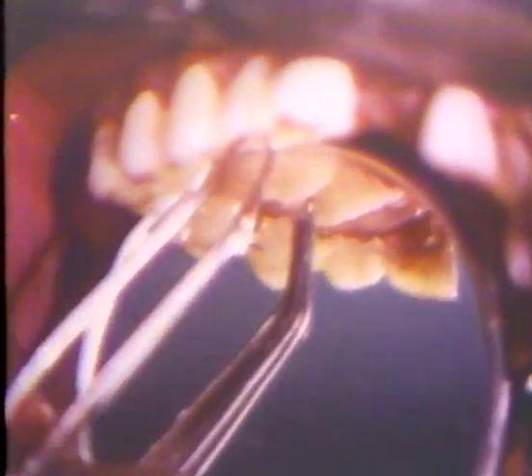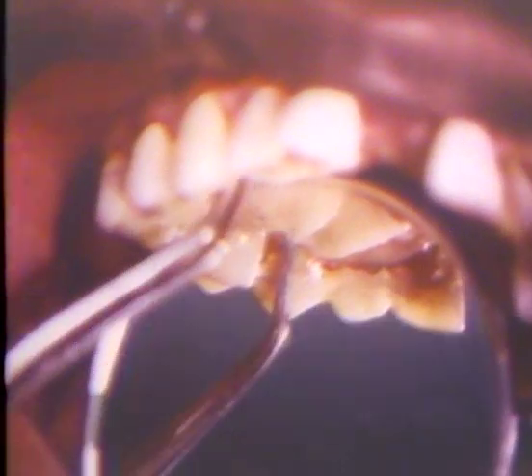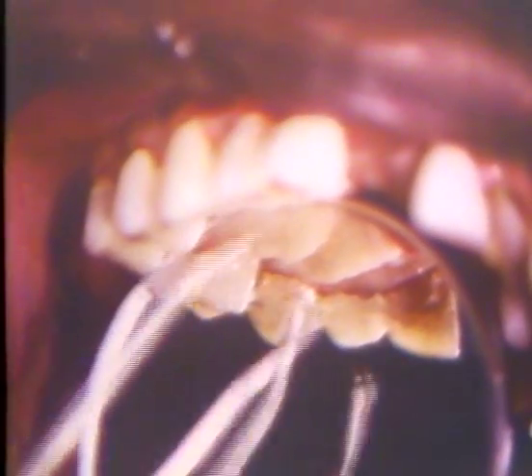Once the pocket mark has been made on the labial and buccal surfaces, the same is repeated on the palatal side. We make a mesiopalatal, a direct palatal, and a distopalatal marking for each tooth in this segment. Again, the beaks are kept parallel to the long axis of the tooth. The greatest depth in this particular quadrant exists on the mesial of the second premolar and on the distal of the first premolar. One notes that the pocket markings extend for a considerable distance onto the palatal aspect.